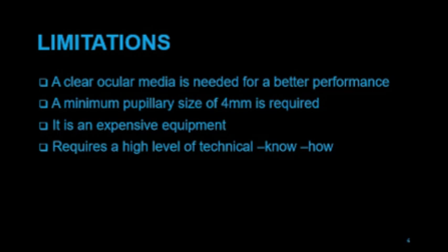Thirdly, it is an expensive equipment. Not every clinic has the luxury of owning one, so it's also a limitation. And then finally, it requires a high level of technical know-how. What I mean is that not just anyone can interpret it. It will take the expertise of a doctor and his team to accurately diagnose and see what's going on in an OCT. Are we together? Yeah, with you, sir.